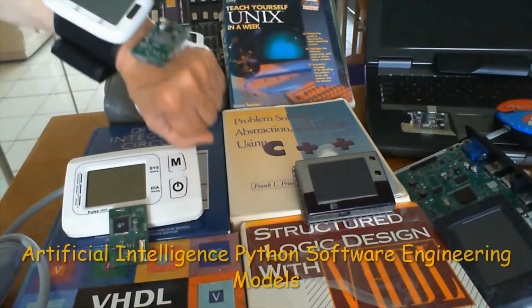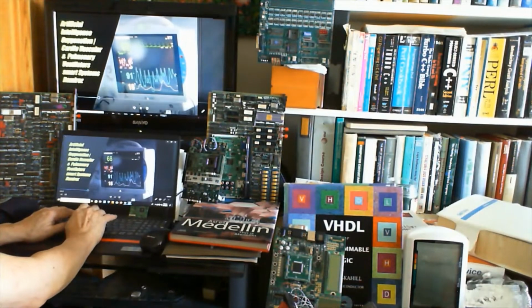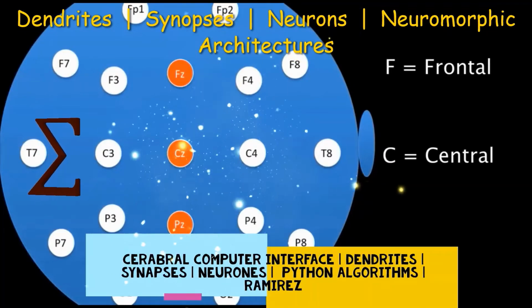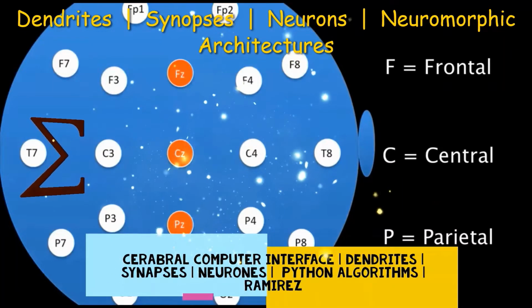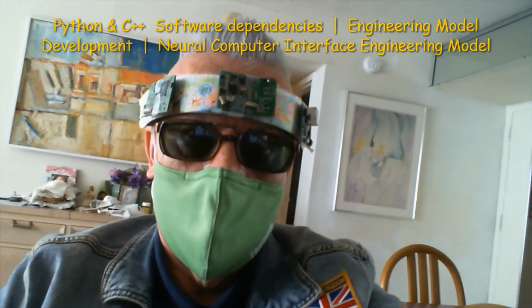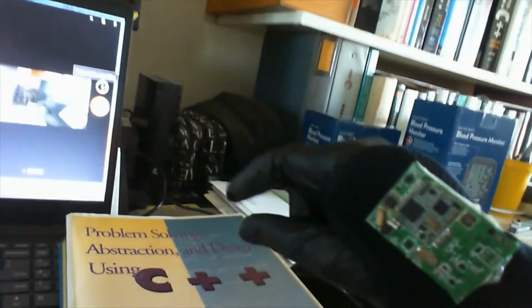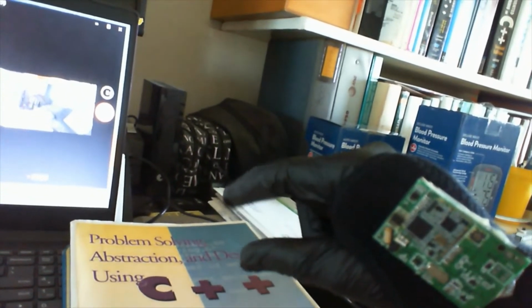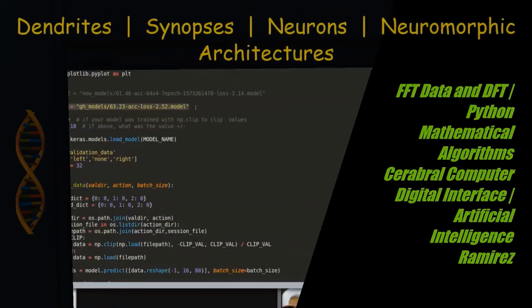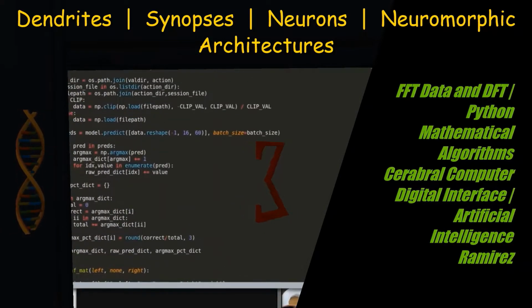These features capture the information embedded in the EEG signal that is relevant to describe the cerebral state to identify, while rejecting the noise and other non-relevant information. All features extracted are usually arranged into a vector, which is also known as a feature vector.